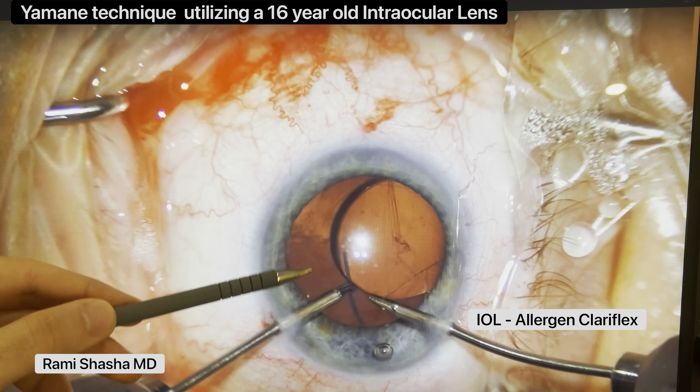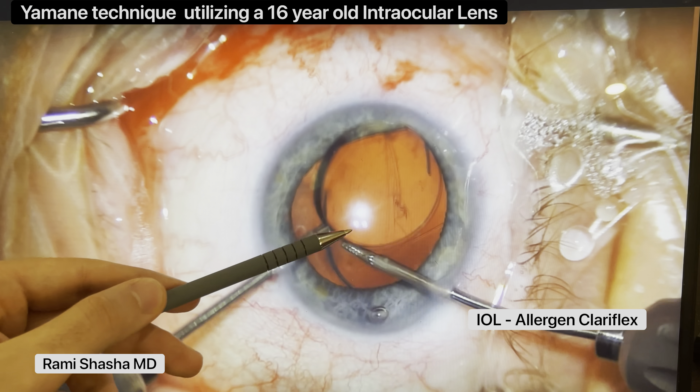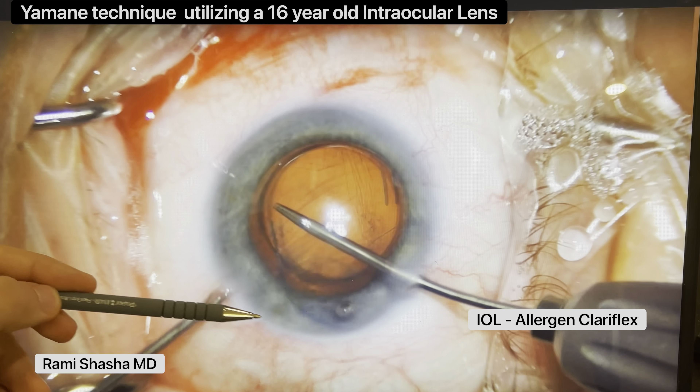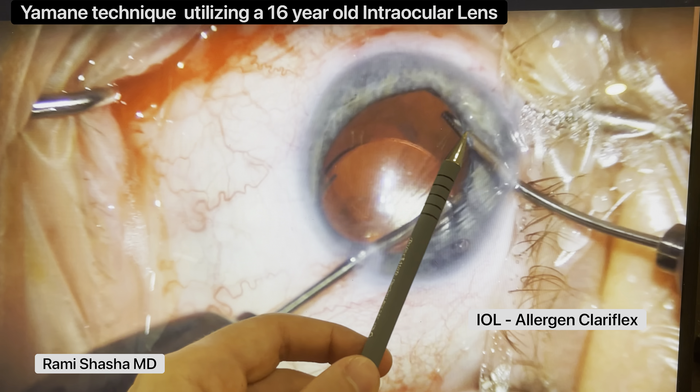I'll do a thorough anterior vitrectomy. And then what I want to do now is I'm going to mobilize this three-piece IOL, which was in the bag. I'm going to mobilize it up and out of the bag, and I want to place the haptics above the iris. I'm using a micrograsper and a microholder for that step, and I'm going to do the same thing for the other haptic.